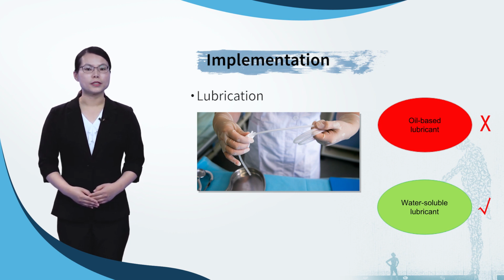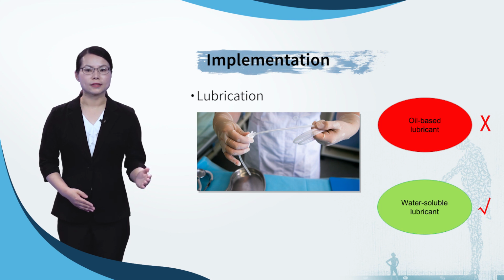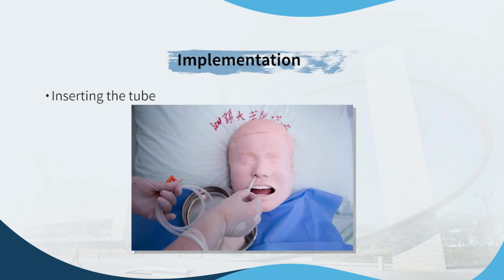If a small bore tube is being used, ensure stylus or guide wire is secured in position. After lubrication, with patient's hyperextended neck, carefully insert the tube into the selected nostril and gently advance the tube toward the nasopharynx. Slight pressure and the twisting motion are sometimes required to pass the tube into the nasopharynx. If the tube meets resistance, withdraw and put it in the other nostril to prevent injury.